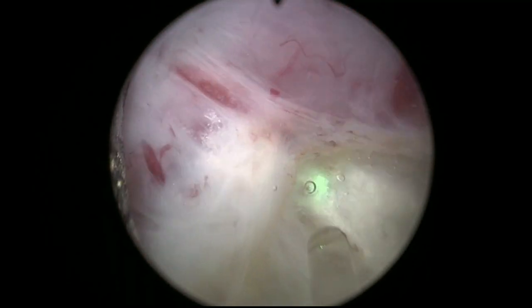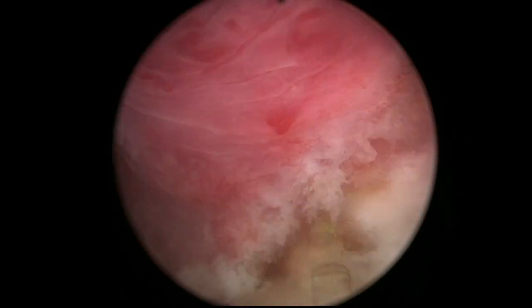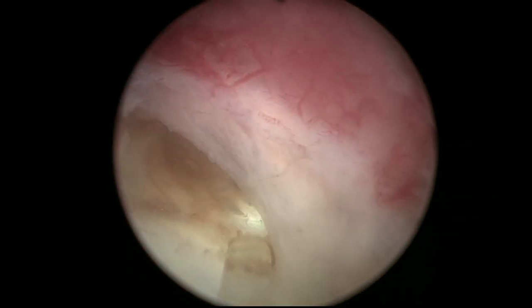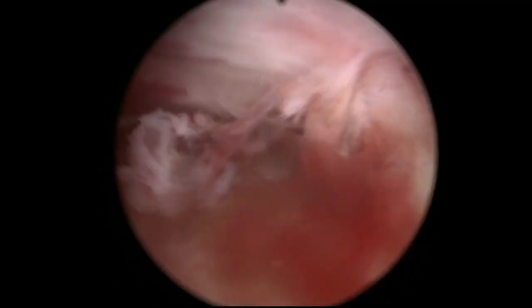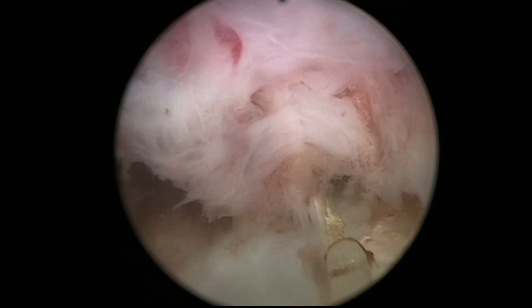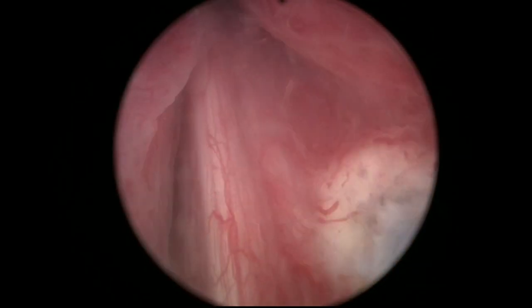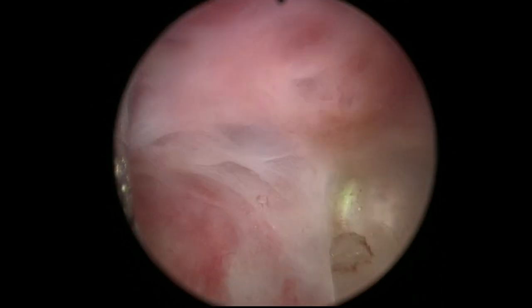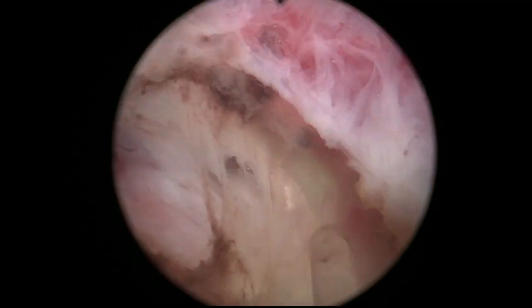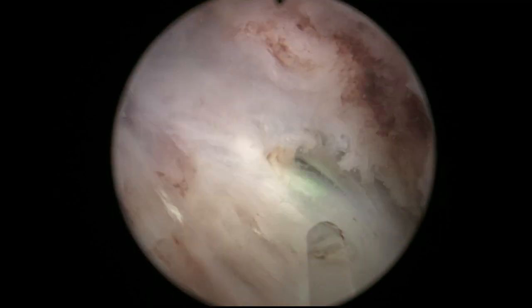With the pulsed Thulium, we get a pulsed laser, but the peak power of each pulse is going to be lower than Holmium, and that will produce an effect that is a little bit different. Probably the size of the bubbles that this laser forms when it does the pulses is not as big, and it doesn't carry this mechanical effect that tends to dissect the plane following the path of least resistance that we use with Holmium. But it does have some effect, and once you localize the proper plane and the proper depth of dissection, it is reasonably easy to follow this plane.